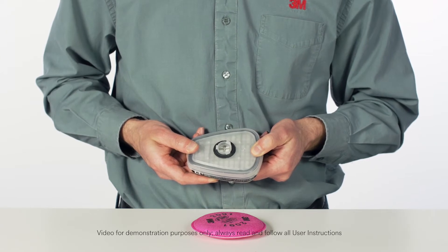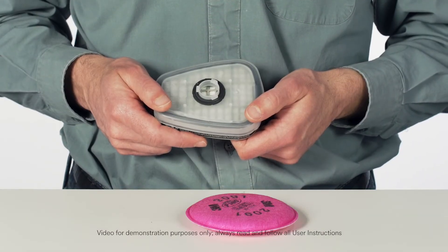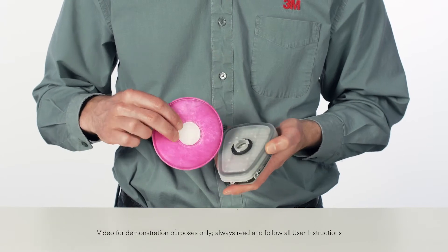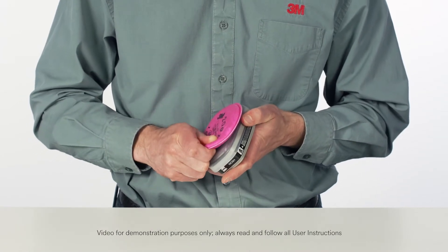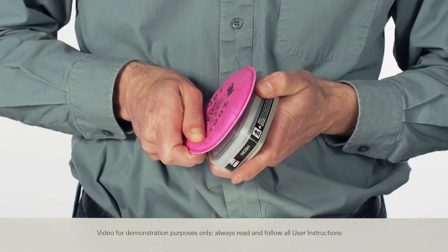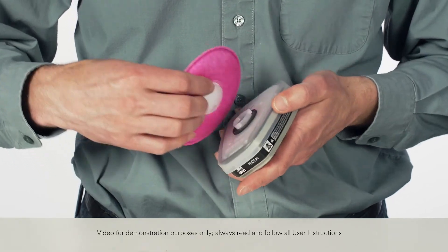The adapter should not be removed and reattached to another cartridge because leakage may occur. Now, align the opening on the appropriate filter with the opening on the adapter and turn the filter clockwise until it stops. Be sure the filter is firmly seated on the adapter gasket or leakage may occur. Cartridges or filters are easily removed by turning them counter-clockwise.